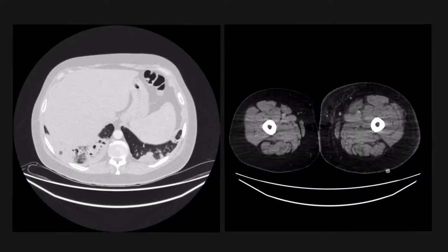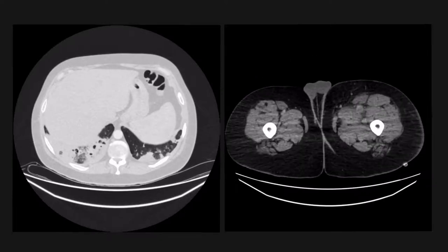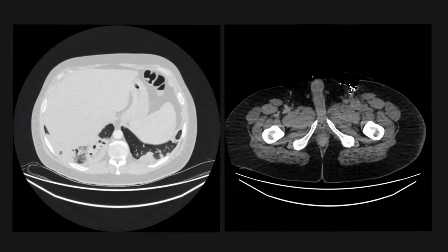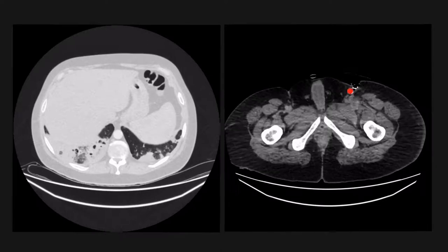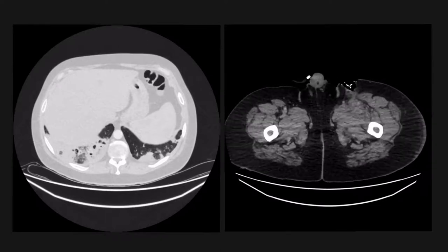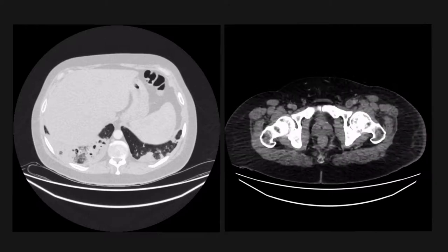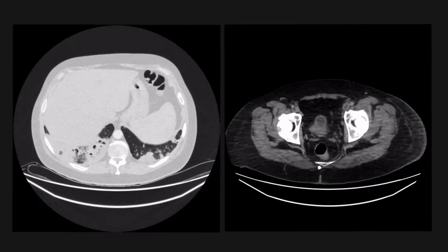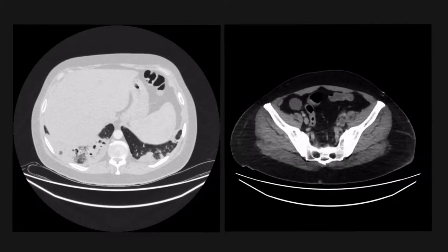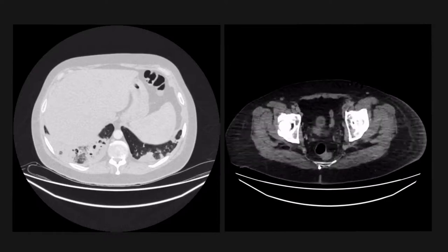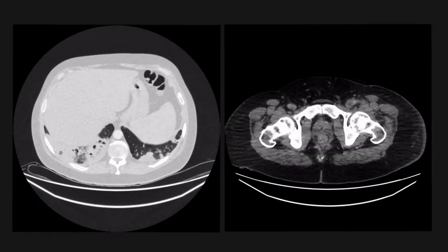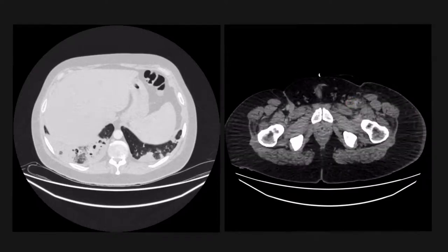Interestingly, on the CT abdomen and pelvis in the same patient, the left thigh is more swollen than the right thigh. There has also been some surgical intervention in the left groin, probably due to a pseudoaneurysm or an abscess. Looking carefully, there is extensive thrombus in the left external iliac vein, and the small amount of air seen here suggests that this is infected.